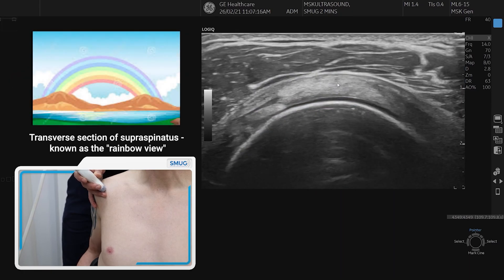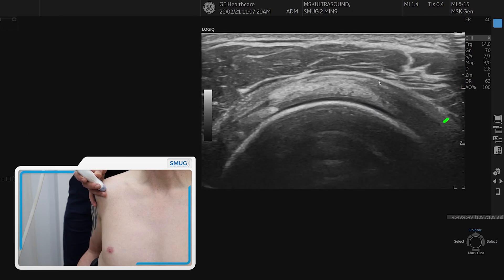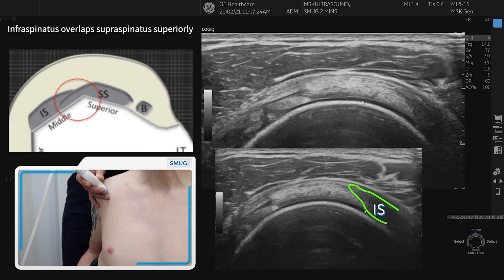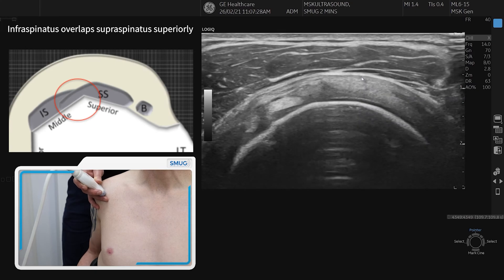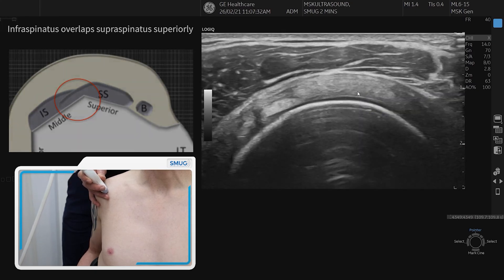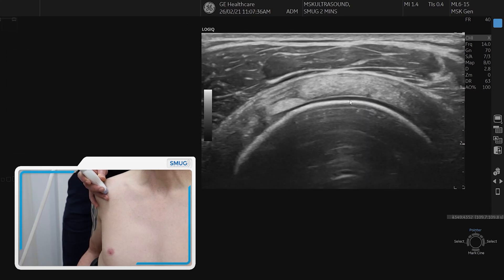As we come round the back, we can see the change in fibre orientation which is the infraspinatus in long section. Over the top we have the subacromial subdeltoid bursa. It's important to visualise all the way through the tendon, coming up and over to see all the fibres, particularly on the footprint.